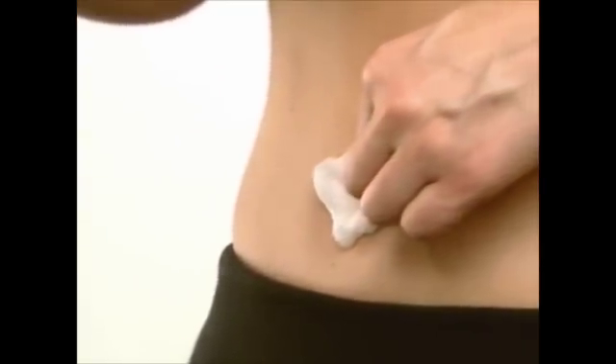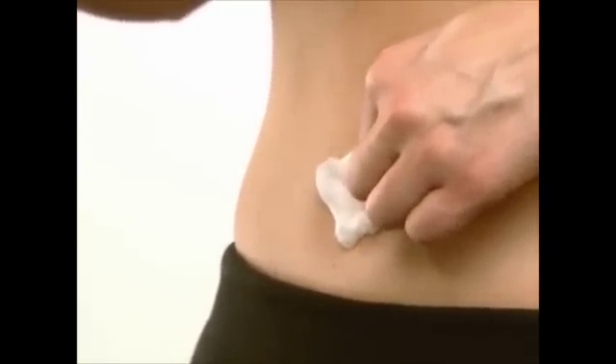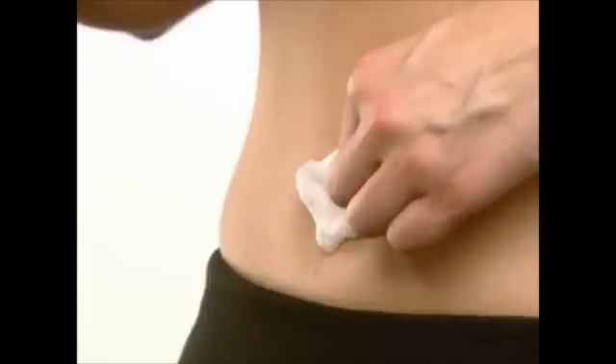Gently withdraw the needle and apply pressure to the injection site using a gauze pad. Discard the empty syringe in your safety container. Congratulations.